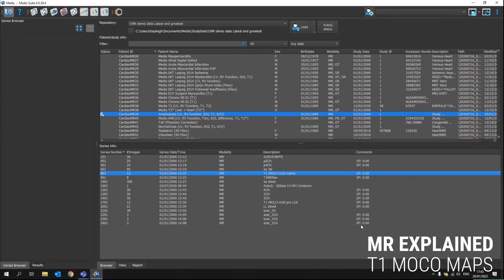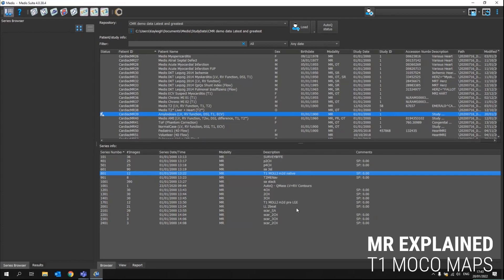If we click on that, it will start running the algorithm. First of all, it will calculate from this series the motion corrected series and from there on it will create a T1 map. Besides the T1 map, it will also generate an R square map so we can see how well the map is.